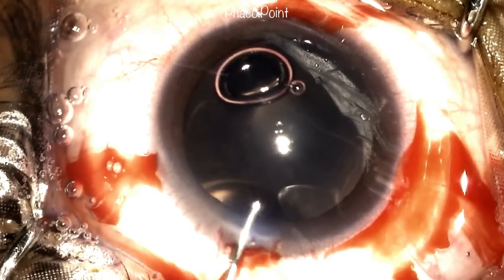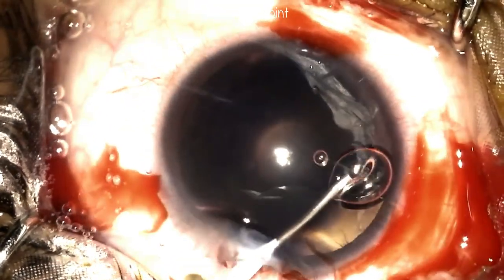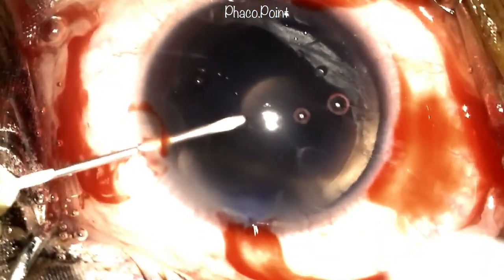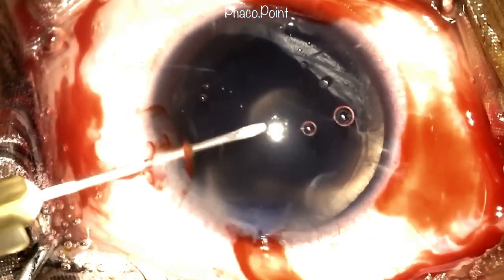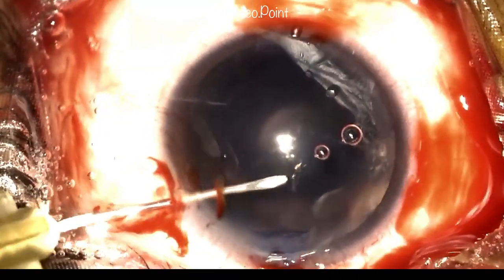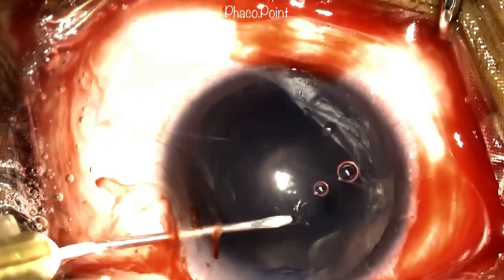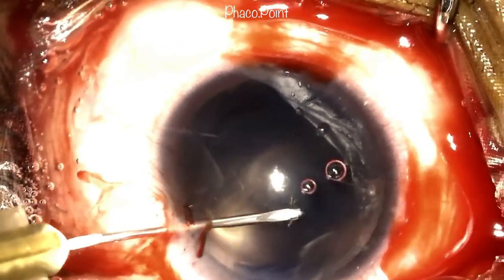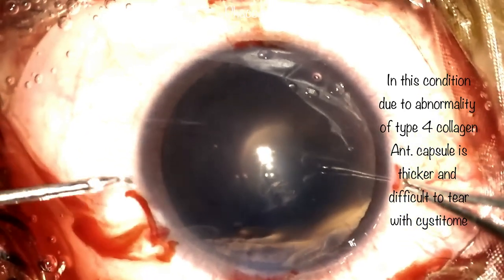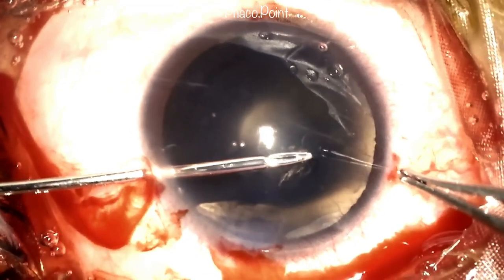This is followed by staining of the anterior capsule. Viscoelastic is introduced into the anterior chamber prior to performing the capsulorhexis. What's different in these cases is the central protrusion of the lens, so whilst handling instruments in and out of the eye — whether staining with blue dye or viscodilating the anterior chamber — we must ensure the instrument tips do not damage the anterior capsule. It can also be challenging to initiate the rhexis in anterior lenticonus. Once it's brought out into the normal lens, it remains like a regular capsulorhexis. Because of difficulty proceeding with the cystotome, the surgeon resorted to intraocular forceps to complete the capsulorhexis.